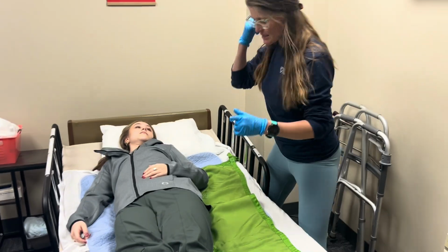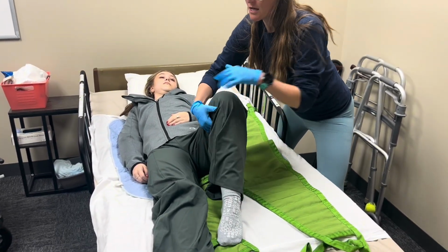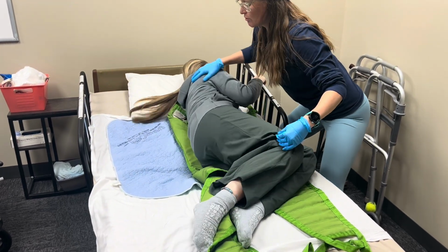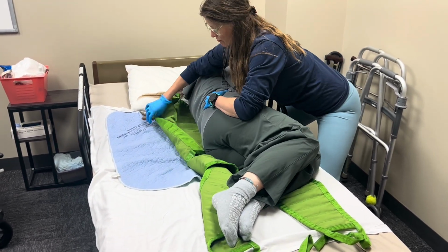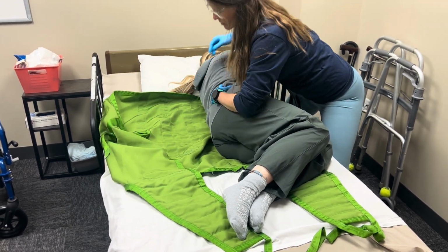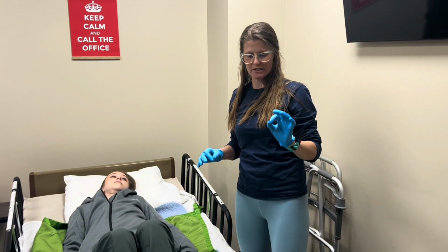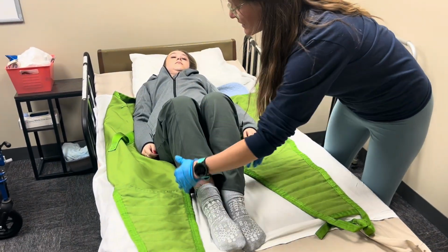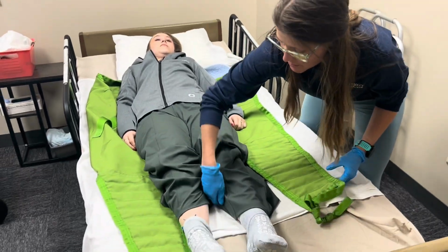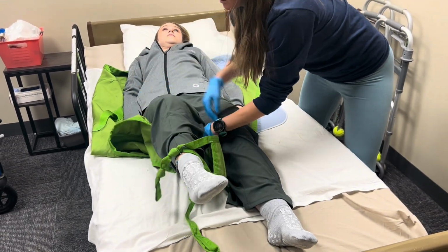And one way that I really like to get my bed-bound clients to roll is we're going to bend this left knee. Great. Can we bend this other knee? Perfect. Can you reach across your body? Perfect. We're going to roll. Now, because I did a roll with the sling, I can unroll the sling. And then, Miss Michaela, we're going to lay on your back. This is where this style of Hoyer sling is really important. So straighten your legs. These straps are crisscross applesauce. So I'm going to put it underneath your leg, and I'm going to put the other one underneath your leg. Great.